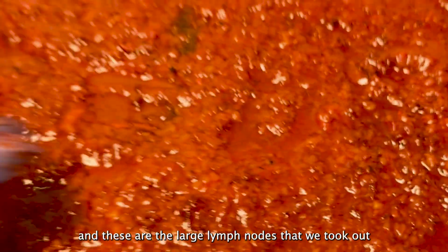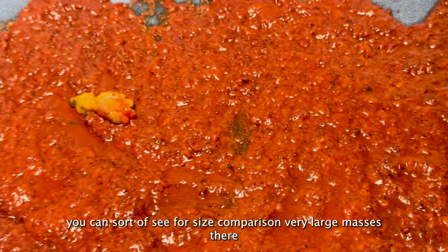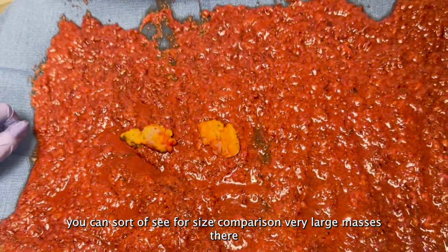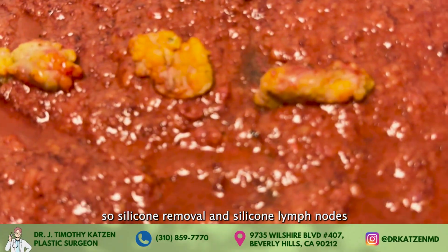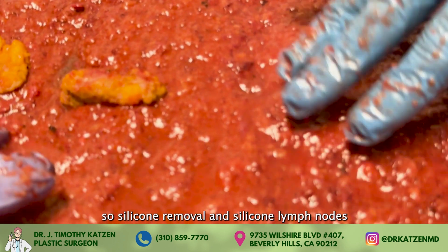And these are the large lymph nodes that we took out. You can sort of see for size comparison, very large masses there. So silicone removal and silicone lymph nodes.